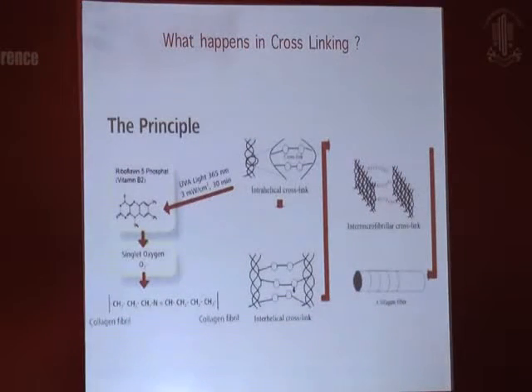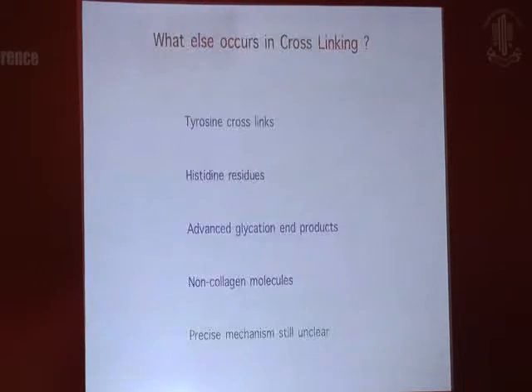In the stromal level, when we do the process that we just saw in the previous slide, what apparently happens is that there are cross-links or covalent bonds that are formed between the amino groups of the adjacent collagen molecules, and this occurs both intra and interhelix. It also occurs within and between lamellae, and all of this is what contributes to the increase in corneal rigidity. And this was how we traditionally believed when we started cross-linking that it worked.